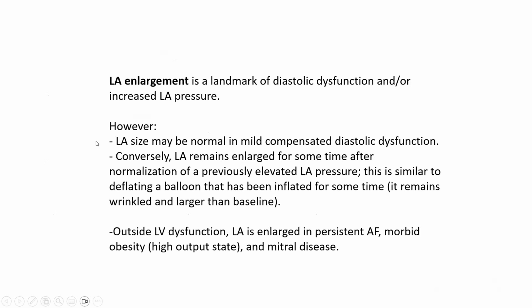Now I want to describe LA enlargement. LA enlargement is a landmark of increased LA pressure at some point, not necessarily right now. LA enlargement is highly sensitive in telling us that LA pressure has been elevated at some point, not necessarily right now. And those are the caveat of LA enlargement.